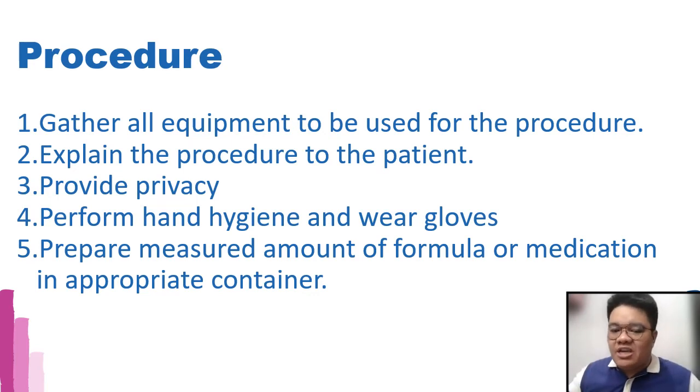Then you go to your patient, you greet the patient, you identify the patient. Always remember that when you are identifying the patient, you are not supposed to ask the patient, are you Juan de la Cruz? That's a very inappropriate question to your patient. What is the best way then for you to identify your patients? Okay? You may do checking of the ID band, but how would you be able to confirm that it is indeed your patient? What would you do, or what would you ask your patient?